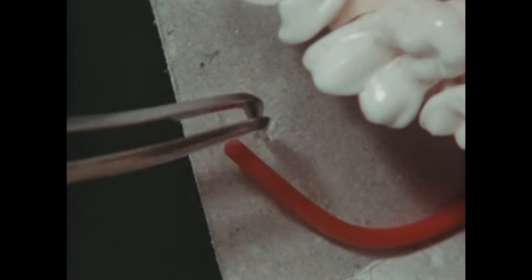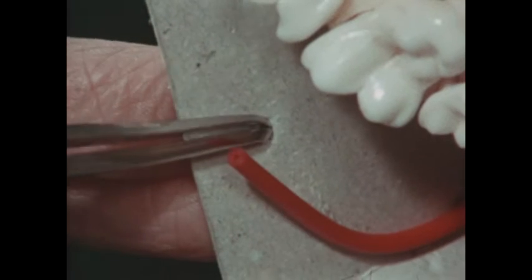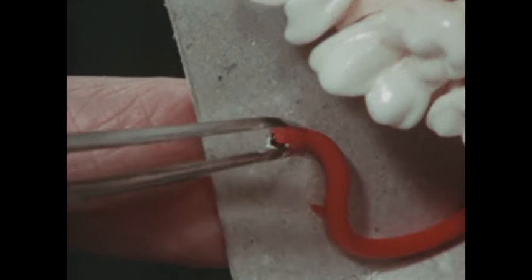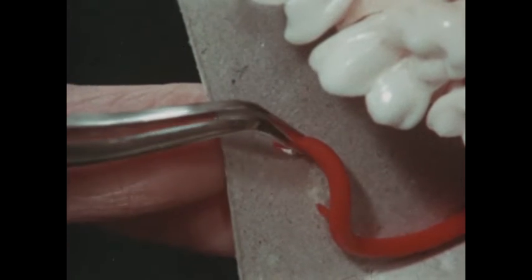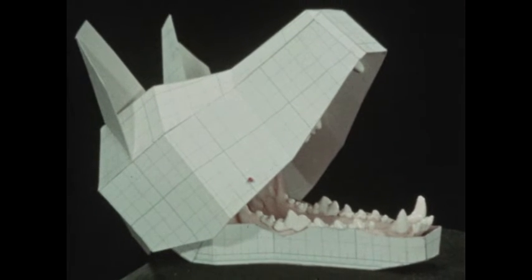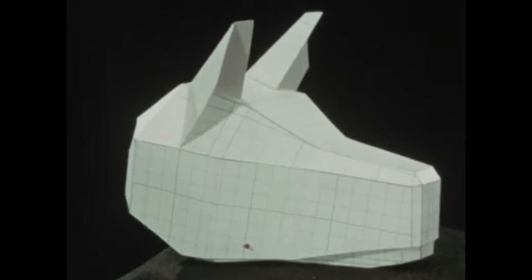Then a small hole is made in the cheek. This will allow the saliva to flow outside the mouth where we can see it. 5 of the 6 glands will still be secreting saliva inside the mouth to start the process of digestion.